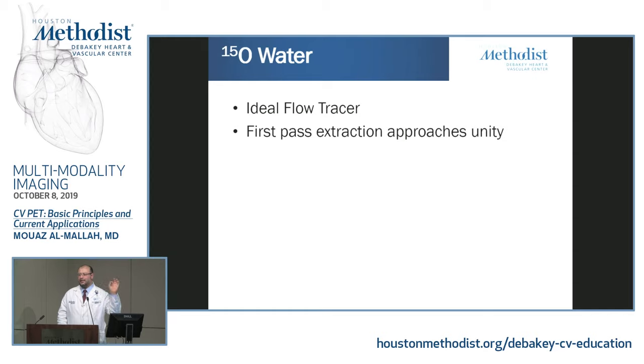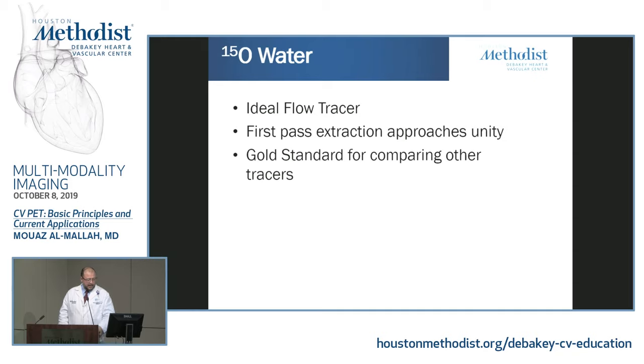However, you cannot create an image with O15 water, and you can primarily measure flow. So for the fellows with us on PET, you can only get CFR. So if the CFR is low because of diabetes, you cannot tell, because you're only measuring flow in there. And now it's the gold standard to compare to other radiotracers for flow, so in research.